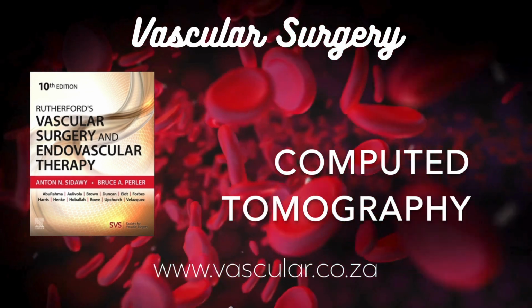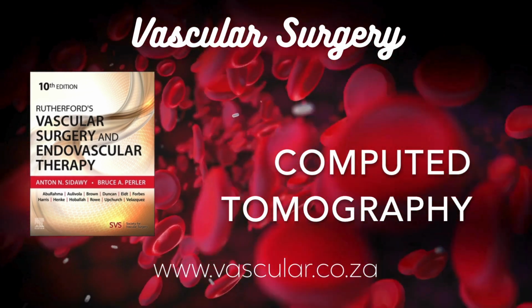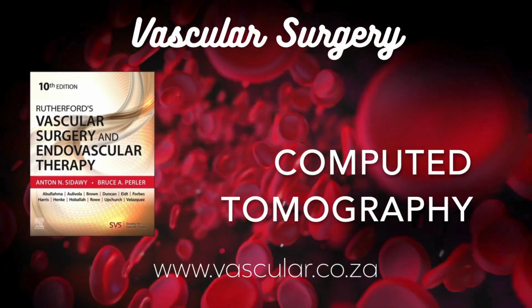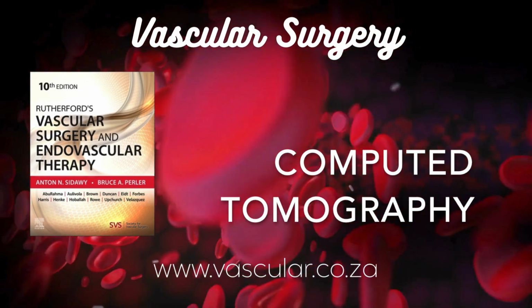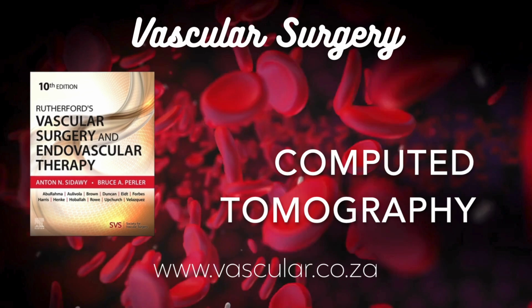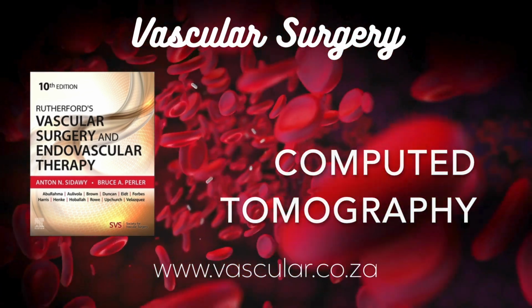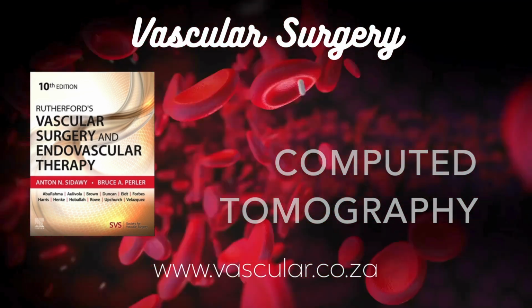You mentioned special care with children regarding radiation. Anything else for pediatrics? The main thing is avoidance, if possible. Ultrasound and MRI don't use ionizing radiation, so they're strongly preferred in kids. If CT is absolutely unavoidable, it's ALARA to the extreme. Accept potentially lower image quality if it's still diagnostic, just to minimize that dose. Every mSv counts more in a child.